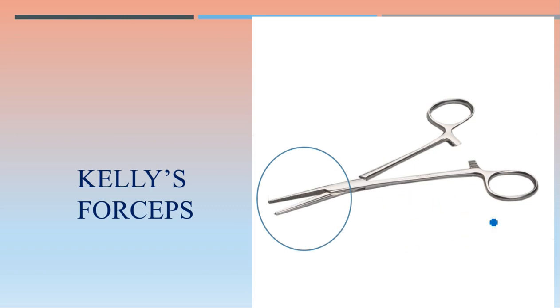Then Kelly's forceps — it looks like this, almost similar to a medium-sized artery forceps. Serrations are present, the fulcrum is here, and there is a presence of lock. Any instrument without a lock was Lister sinus forceps — this is Kelly's forceps and the lock is present.